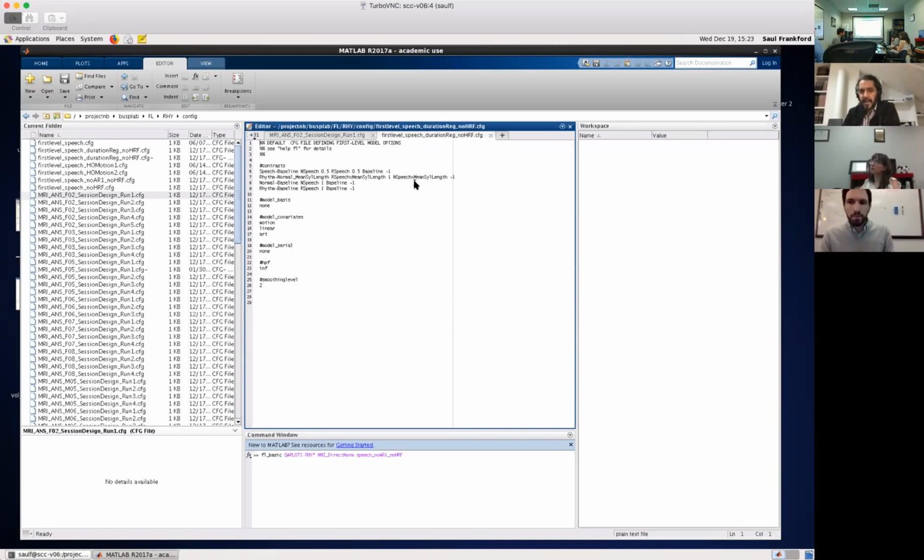So basically, when you create these parametric modulators, these new conditions are going to be created for you, which have the name of the individual condition names, then the X for times, and then the name of the modulator. Those are the ones that measure the amount of correlation between the modulator and the BOLD signal within that particular condition. So that's the interaction between those two?